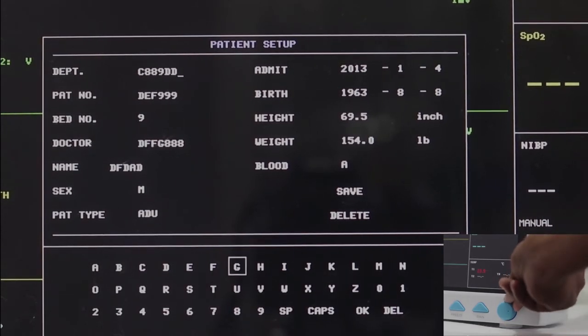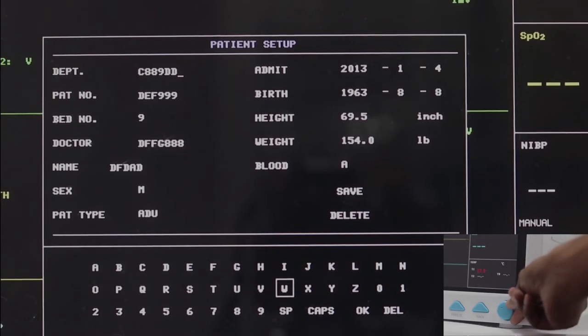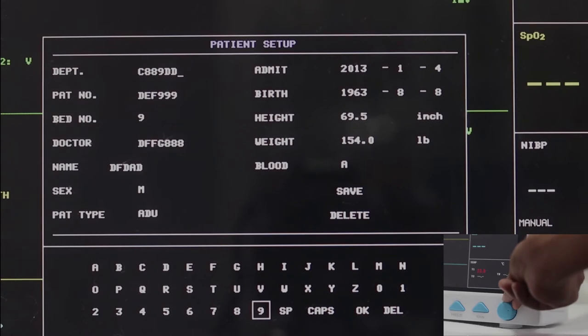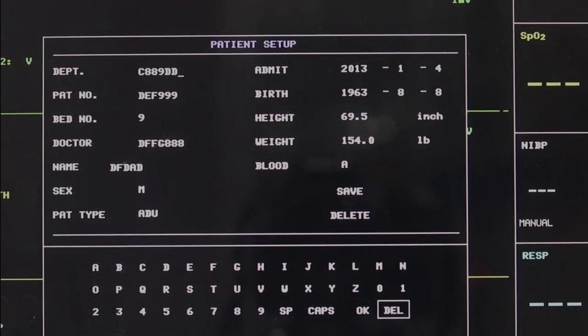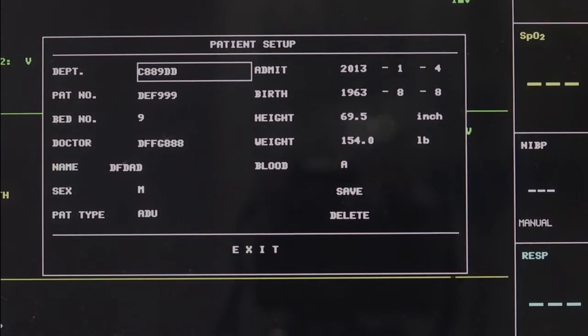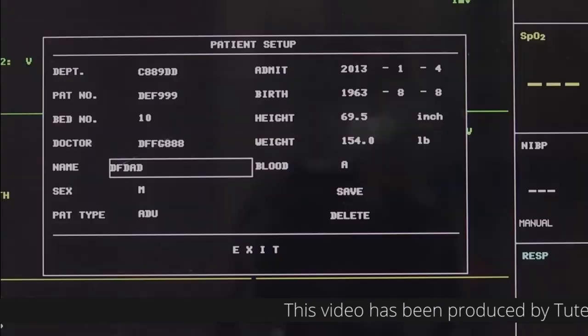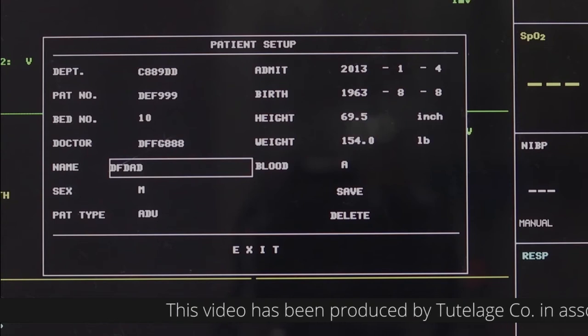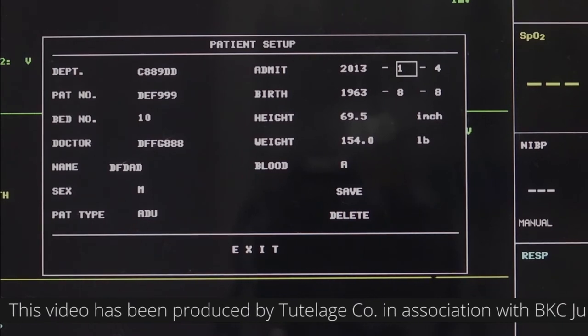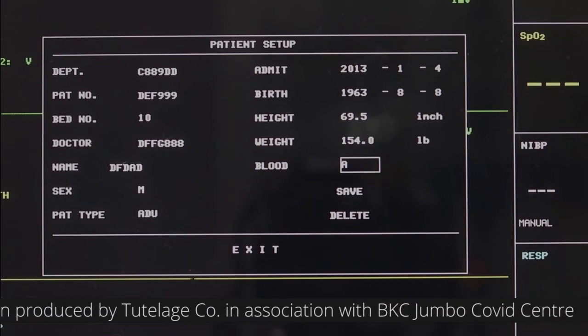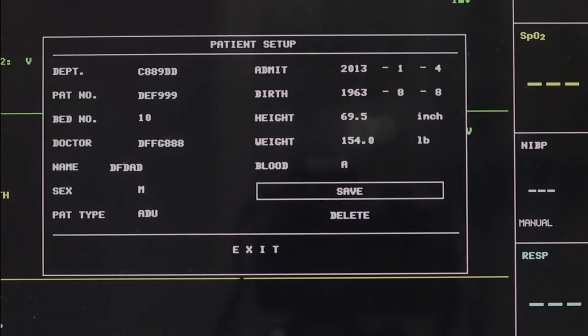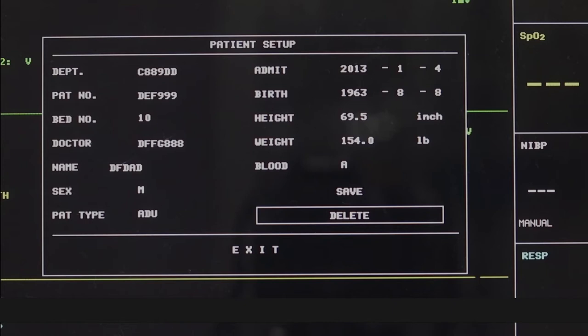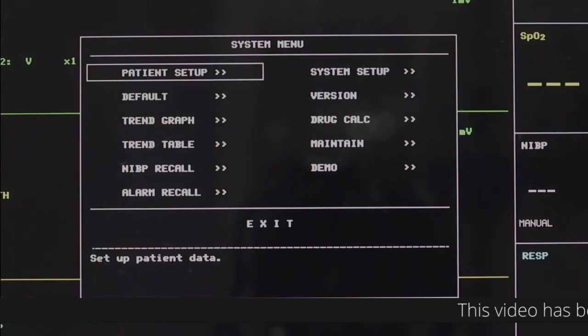You can edit Department, Patient Number, Bed Number, Doctor Name, Patient Name, Sex, Patient Type, Date of Admission, Date of Birth, Height, Weight, and Blood Type. The Save option should be used to save or change or newly add data. The delete option should be used to initialize the patient setup menu. Click on exit to return to the system menu dialog box.